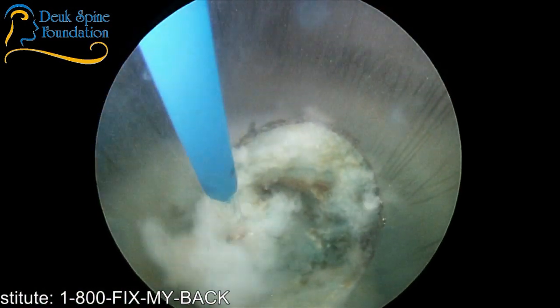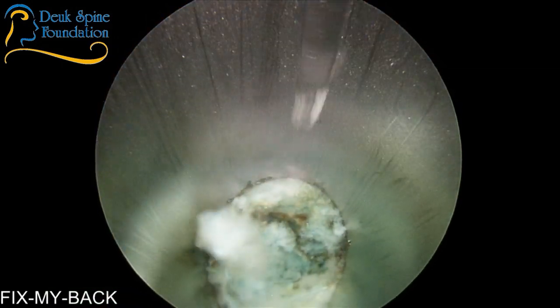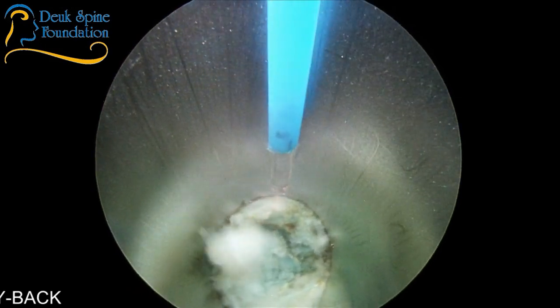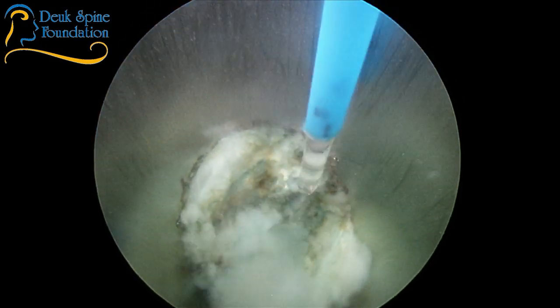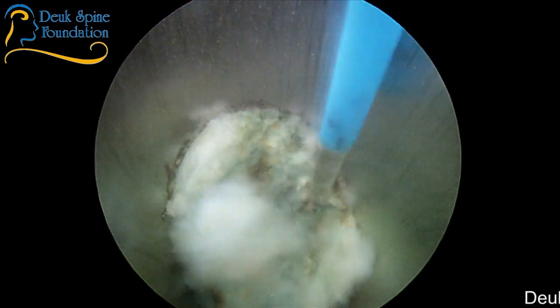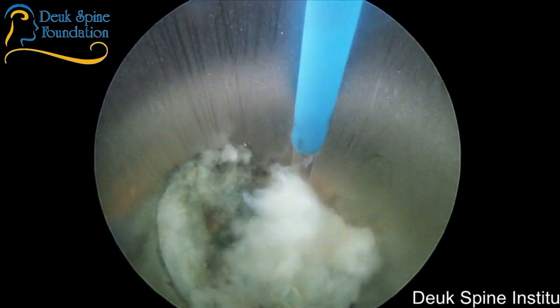If they have a question about what is that blue thing coming up and down and wiggling, that's the laser fiber. It's about half a millimeter in width. It's 550 microns, which is half a millimeter, just to give you an idea of the size of things.